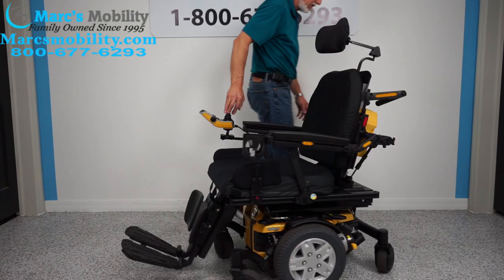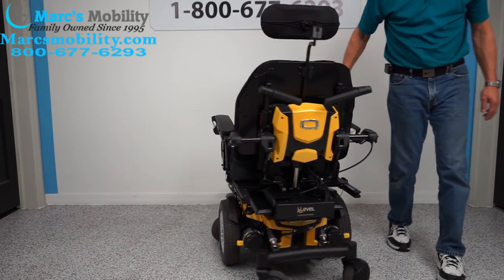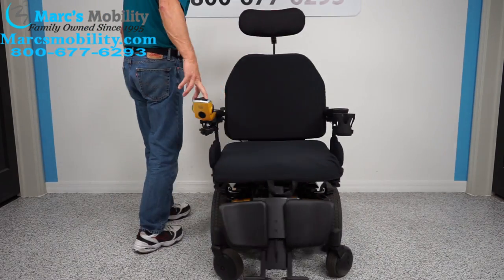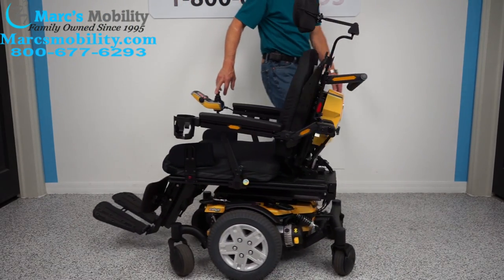Here's how the chair turns if you want to see what it looks like. It's a mid-wheel drive, so it turns around its own length — stays in the same spot and turns around its own length.